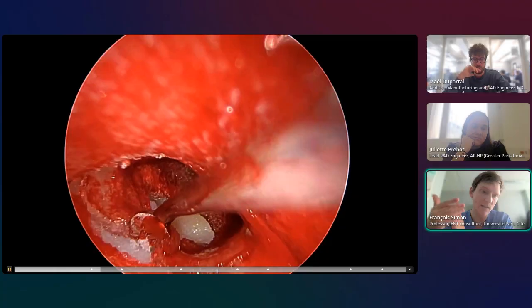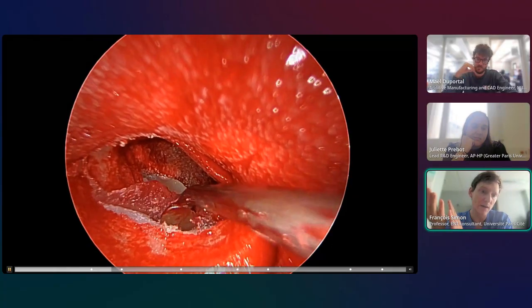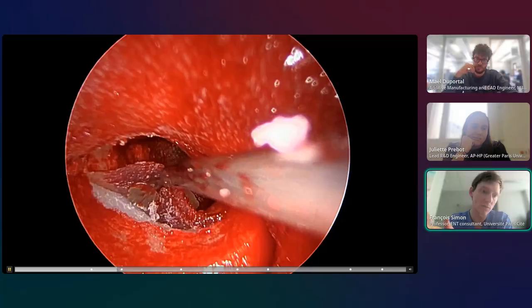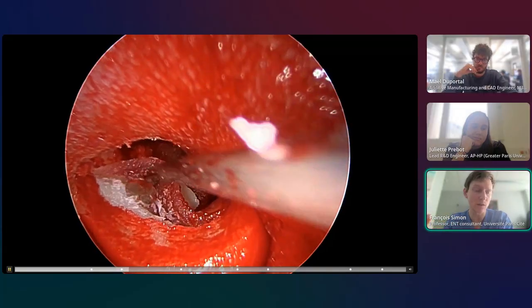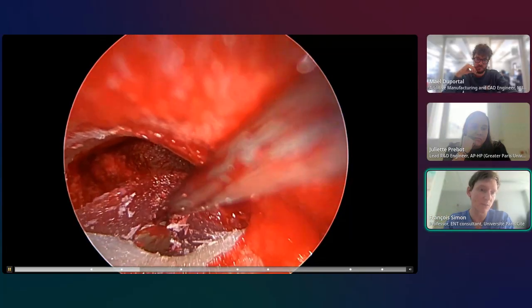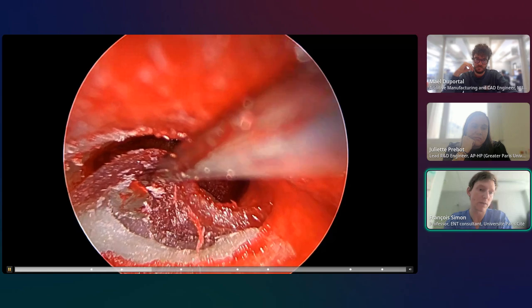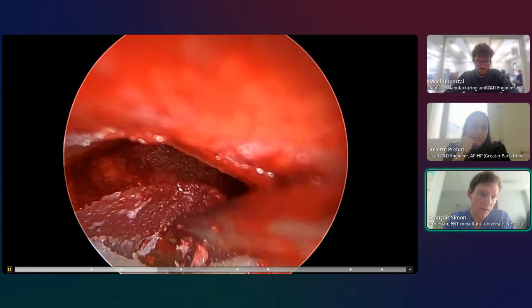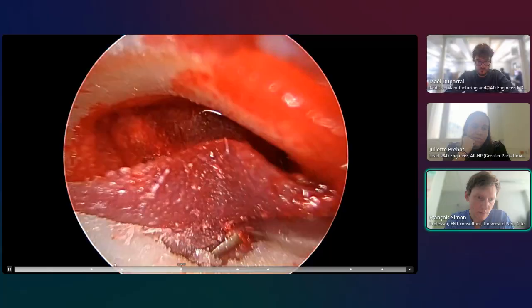And again, this is a difficulty when you have bleeding in these cases. So when they're beginners, you can put just a little bit of blood. If you want to simulate a very bloody surgery, which is again real life, it can happen. You can add more blood and make it more realistic or more complicated, and adjust this to the cases. So maybe we can move on to the next slide.